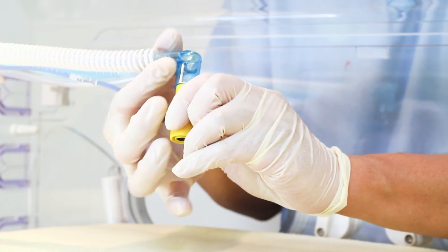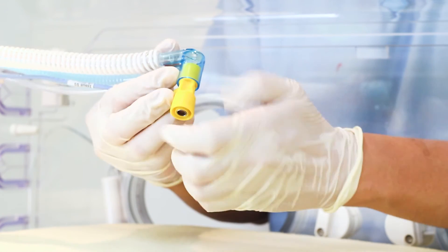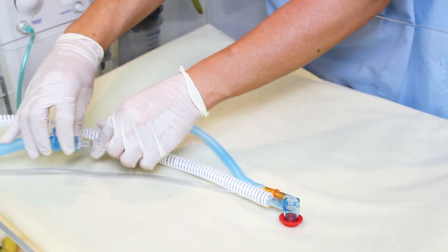Attach the flow sensor to the patient end Y-piece and cap. Check that the probes are firmly seated to avoid leaks and ensure the tip is correctly positioned.